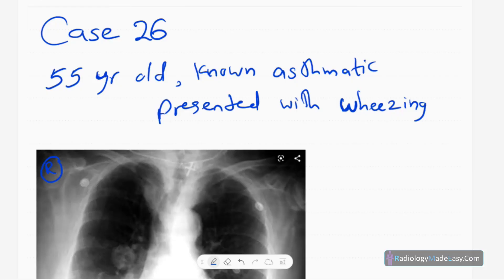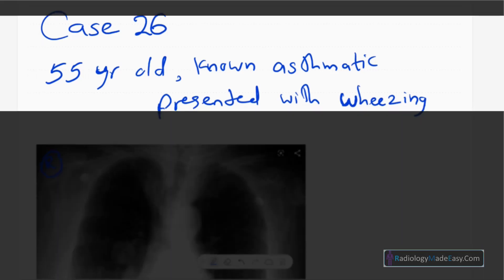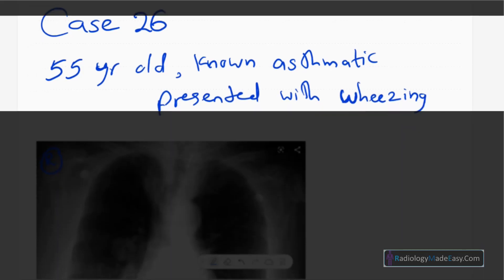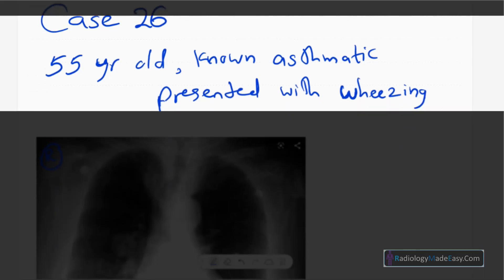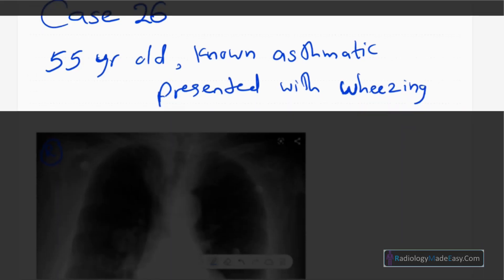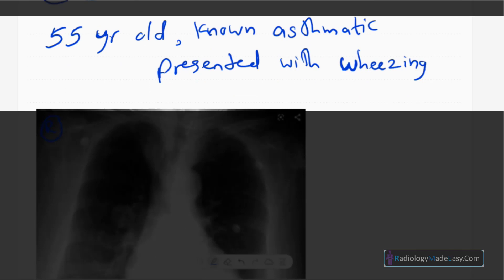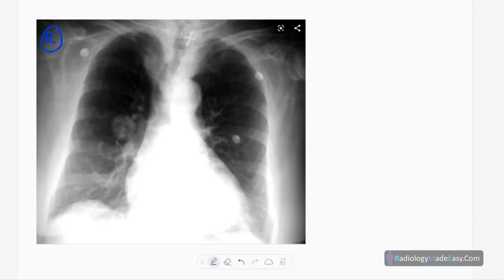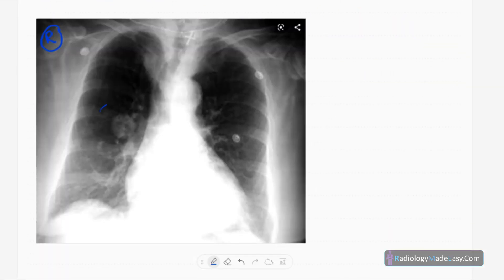Welcome back everyone. This is case number 26 of the RS series in radiology. Today our patient is a 55-year-old known asthmatic who presented with episodes of wheezing. This is the frontal chest radiograph of this middle-aged male patient.